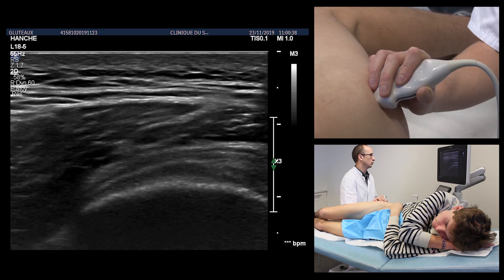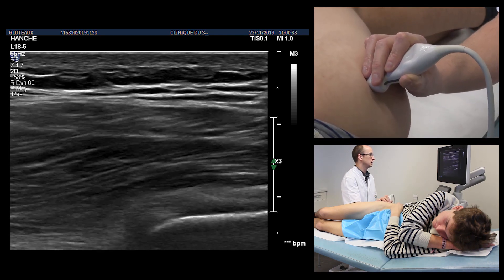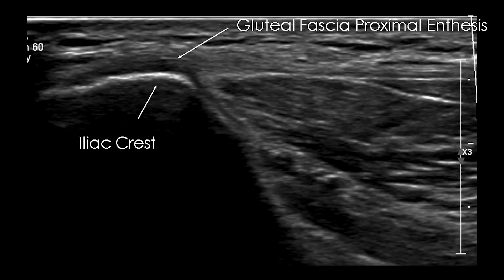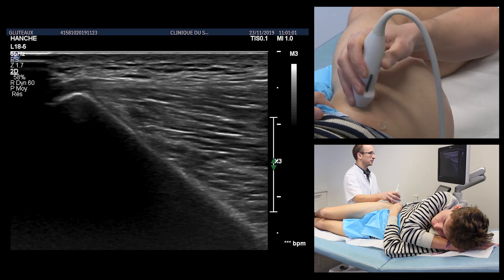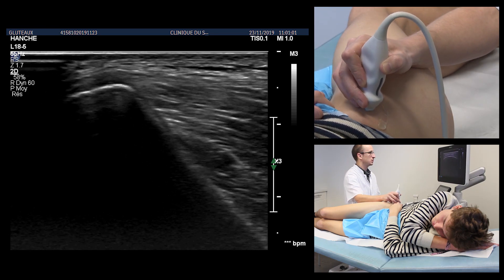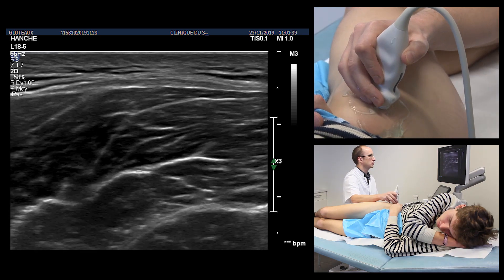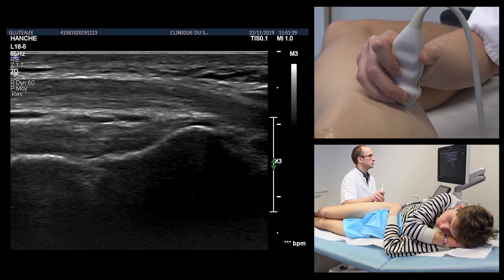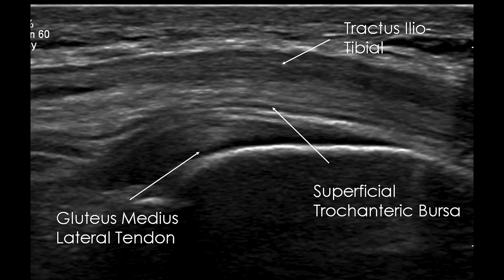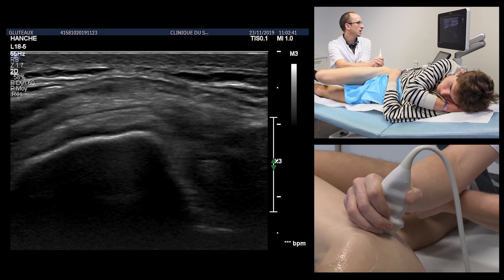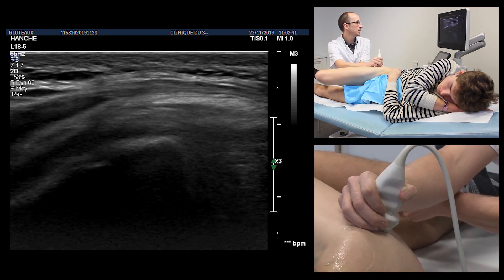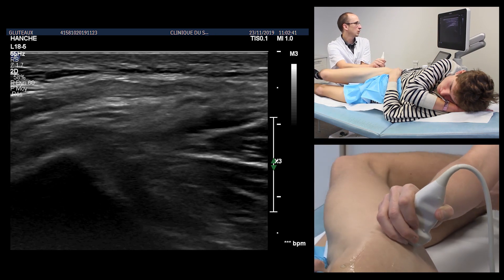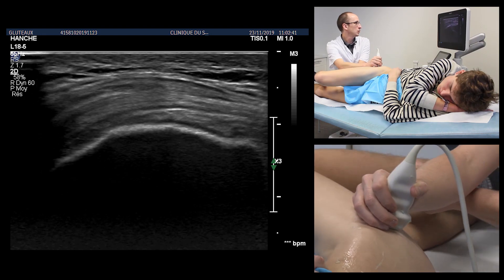A posterior vertical oblique rotation of the probe will allow visualization of the distal part of the tendon and its enthesis. The study of the proximal enthesis of the gluteal fascia and the tensor of the fascia latae is performed at the level of the iliac crest by placing the probe perpendicular to it. The enthesis is visible as a fine fibrillar structure which runs vertically downwards to the surface of the gluteus maximus and is positioned at the superficial part of the greater trochanter, separated from it by the superficial trochanteric bursa. The possibility of hip lateral snapping is assessed by axial section at the level of the greater trochanter. Dynamic maneuvers are performed in slight flexion and extension of the hip to assess the passage of the iliotibial tract over the greater trochanter.